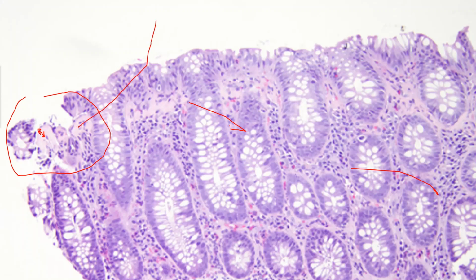But you can see that the 10 micron is the best way to describe it when you measure: if it can fit 2 red blood cells, which will be 14 micron, then you are above the 10 micron, then you are in the area of diagnosing collagenous colitis.